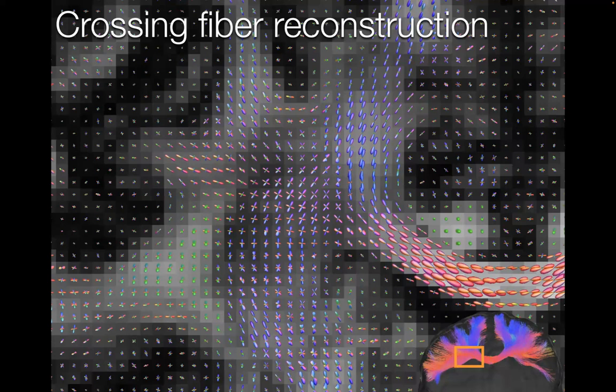With DTI, and I'll show you an example, I was just getting this. As soon as I was getting here, it's like, I don't know where to go. And you're pushed towards the mean, and you go up. Impossible to traverse this traffic jam. These hot spots of low FA. You see behind I put FA. These are all locations where the tensor is a disk or even a sphere. When you have three-way crossings here, this is actually a sphere. It's a perfect XYZ track crossing.